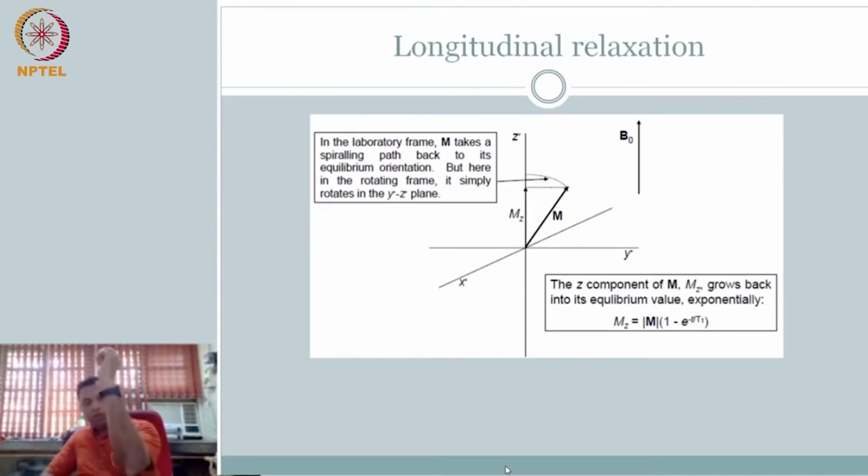I can allow the excitation, push it down, record the signal, no issues. But now the question is, there's one more capability that we can do that will allow us to notice this T2 or T1. Both of these are also characteristic of the material, right? Or the sample volume. So if you're talking about hydrogen, if the neighbors are slightly different at that location, then you're going to have a different T2, right?